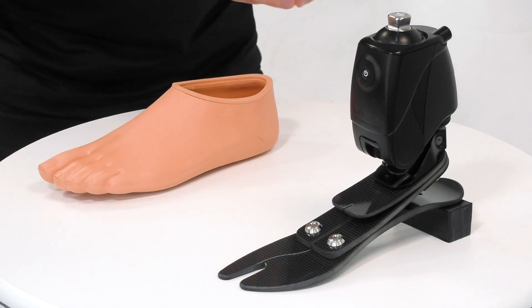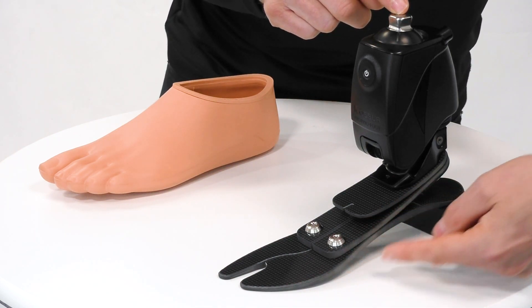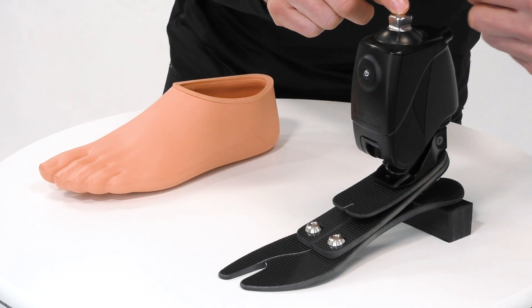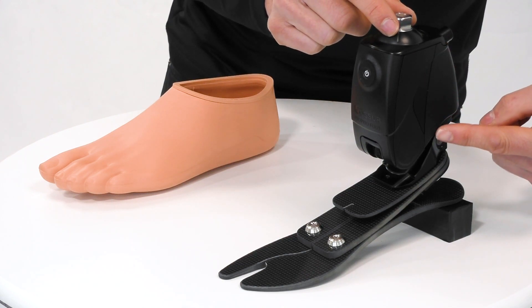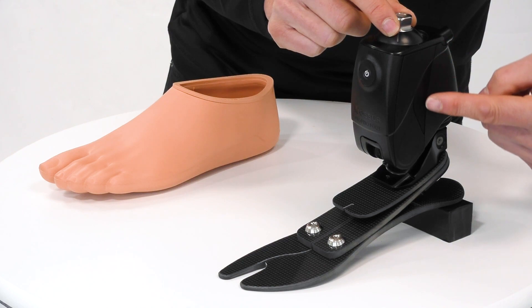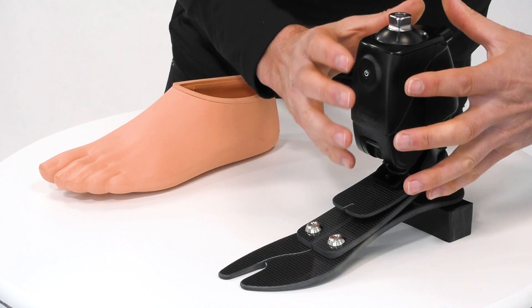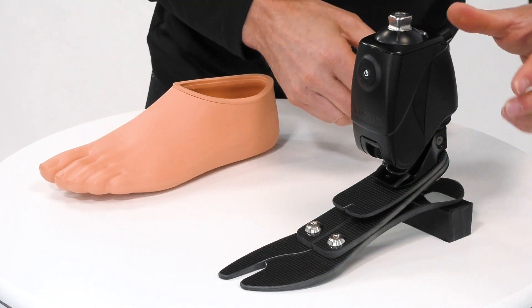Here we can see the complete Proprio unit, which is comprised of a foot module and an ankle module. It's inside the ankle module that we have a motor powered by batteries, controlled by sensors working together to give us the enhanced functions that we want.